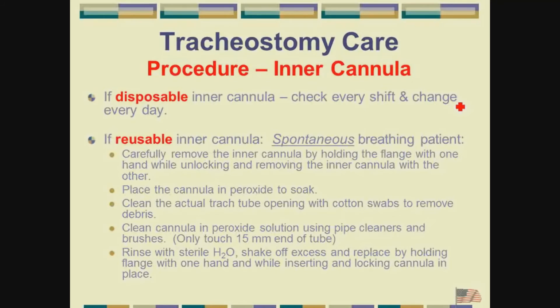So unlocking it means I have to turn it counterclockwise and remove the inner cannula from use. I'm going to take that inner cannula I just took out and drop it into the peroxide mix that I have there.